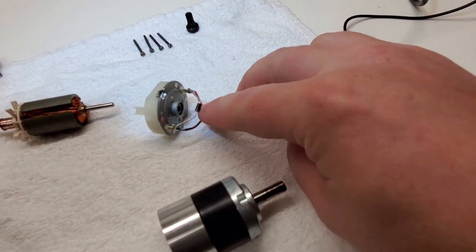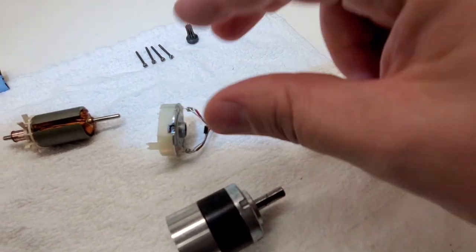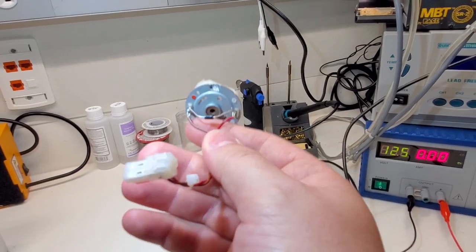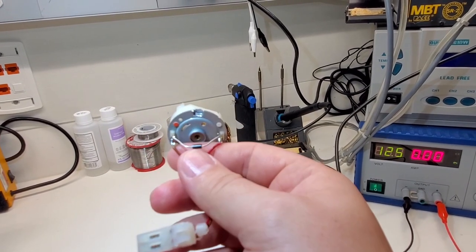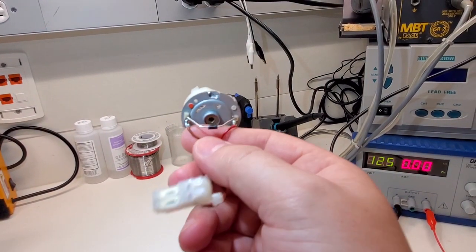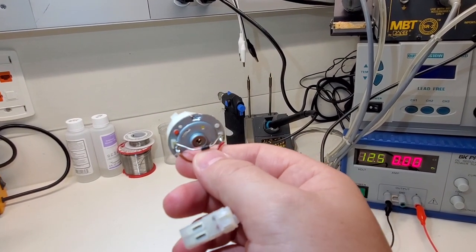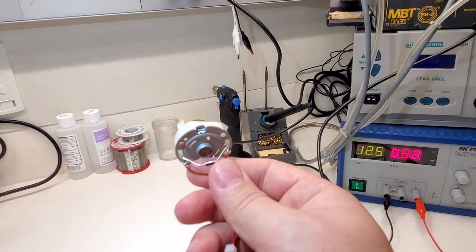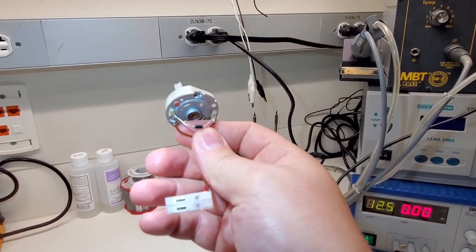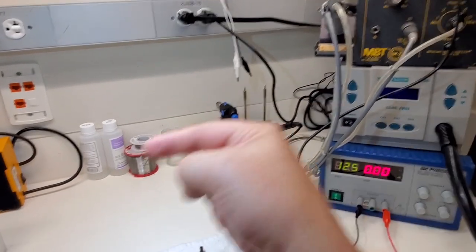So what you have is this bleed off diode. In normal operation, this guy is reverse biased and the electricity runs through the motor. But when you disable the motor, when you shut off electricity, that spike of electricity backfeeds in reverse through your wiring, and it crosses this diode, because now this diode is forward biased. So now the electricity can go through the circuit and bleed off naturally instead of backfeeding.